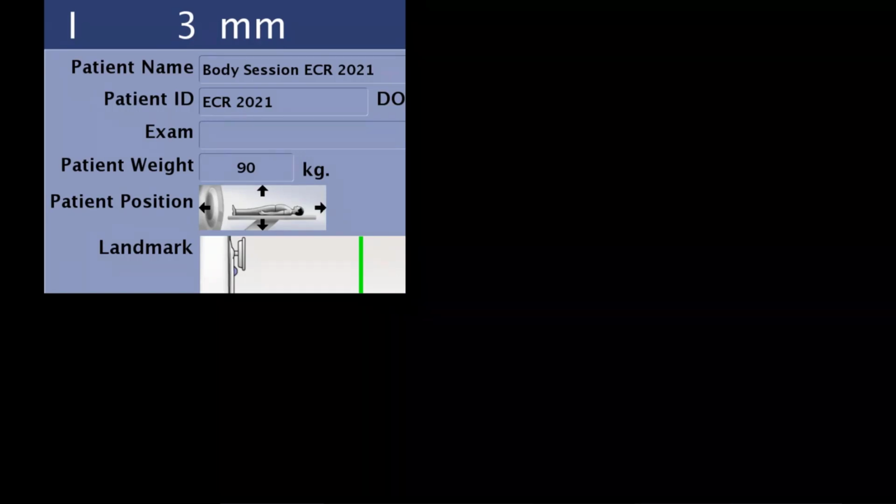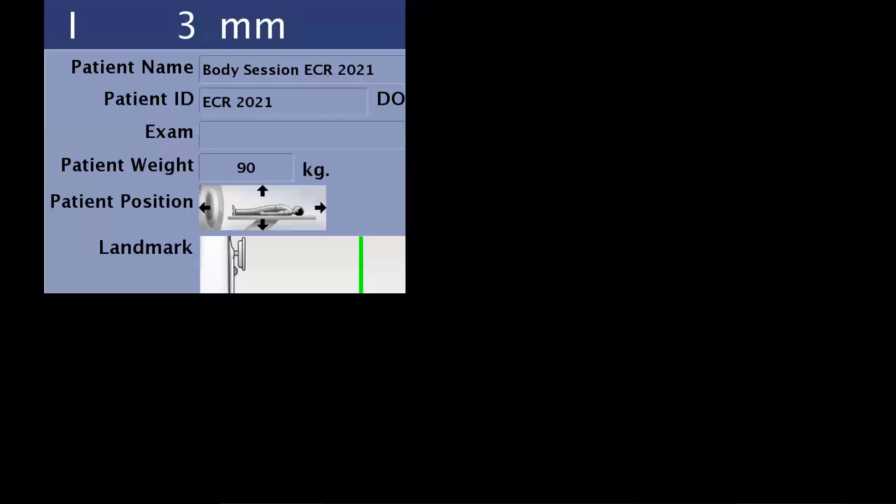The same would apply to a camera. Maybe some of you are shooting in the RAW format, some of you in the JPEG format. As always, when you start from the raw data, you're not throwing away anything of what you acquire. That's why you can have an impact on image quality, as what you've just displayed.